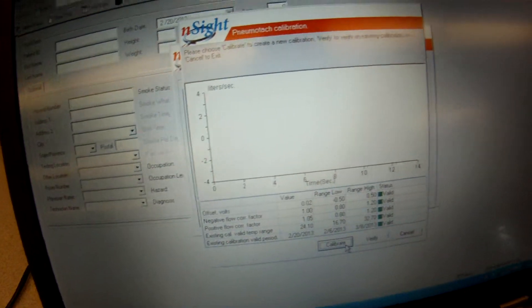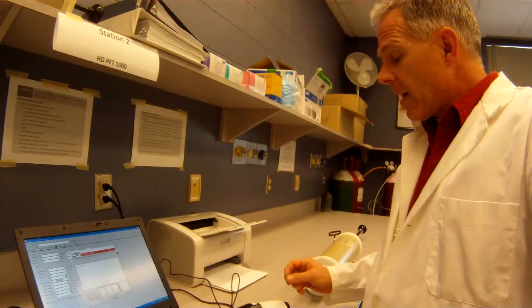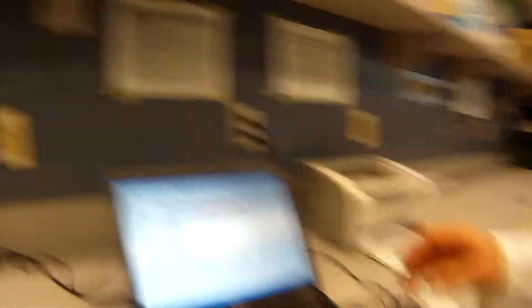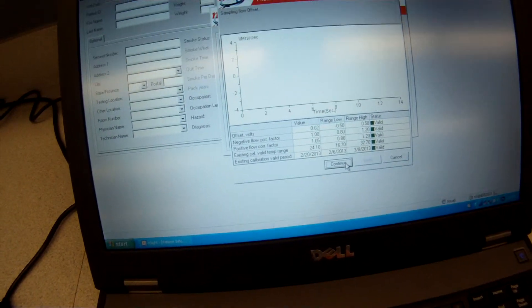I'll also show you how to verify this. So we click on calibrate and it says make sure that there's no flow through our device. Now that's important with all pneumotacs. Initially you want to make sure there's no flow through there. Then it comes back and says continue. So we go continue.